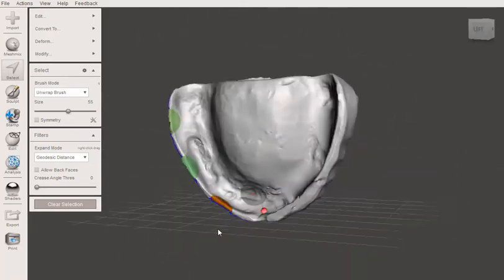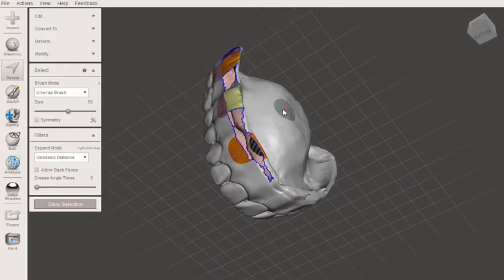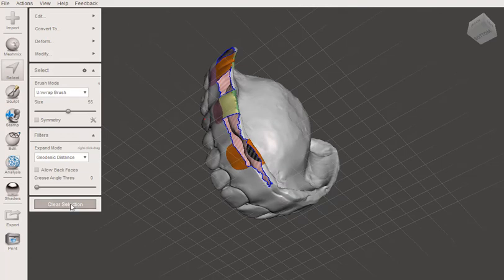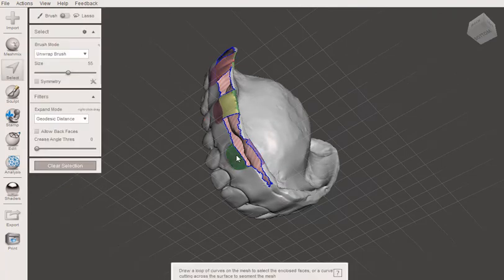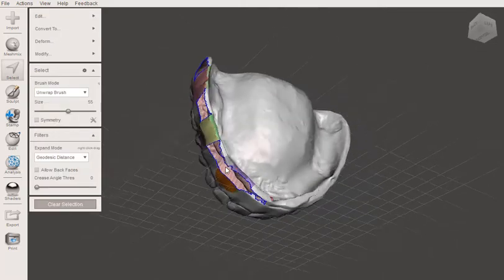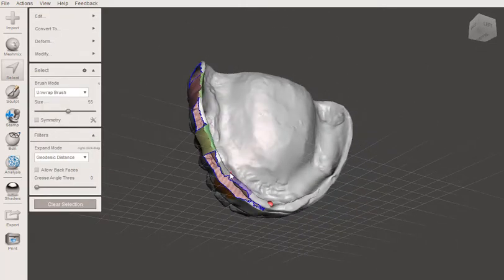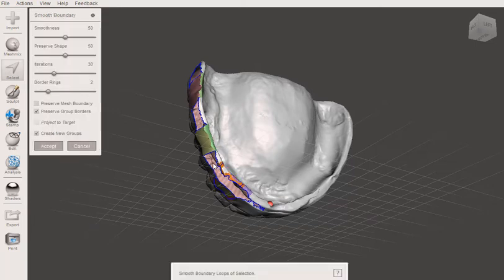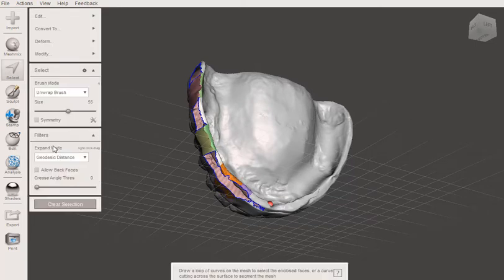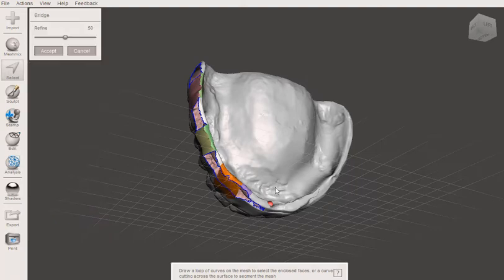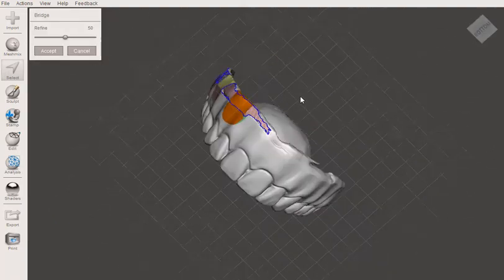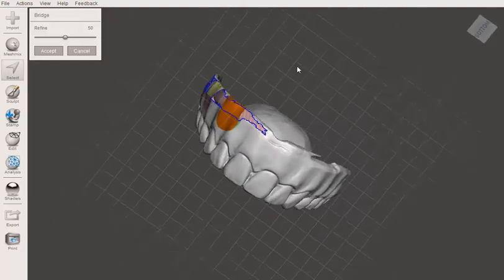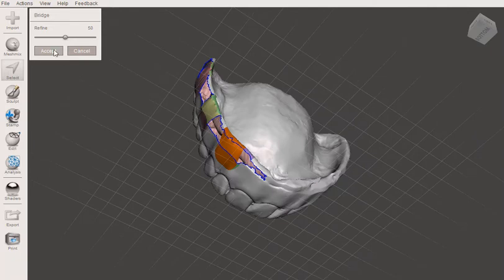So this one, I'll show you what's going on here. So this one isn't quite jiving. So we're going to do this again. Sometimes if they're not quite lining up very well, then it won't bridge. So you have to make sure that it's pretty much a straight shot for the bridge there.